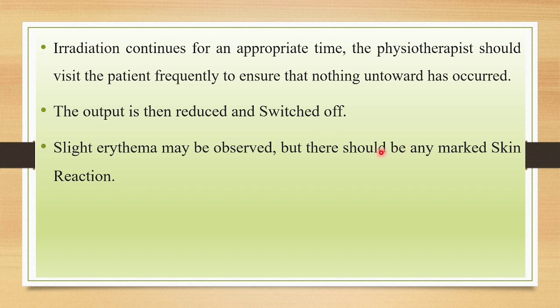Apart from that, if there is increased skin redness, that is one of the dangers. So in order to prevent that, we will be asking the patient regarding the effect of heat. If the heat is not tolerable, we will be reducing the output.